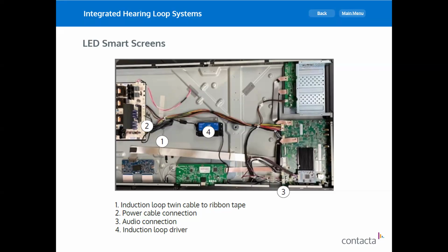It is different than fixed loops, integrated loops, because ultimately I can move around. I'm standing in front of an ATM machine or a checkout desk in the supermarket. I can stand a foot away from it, or 2 feet, or 3 or 4 feet, and I can move around. But it doesn't mean that I can't measure it according to the IEC requirement and commission the system.